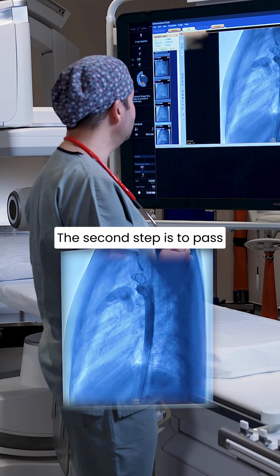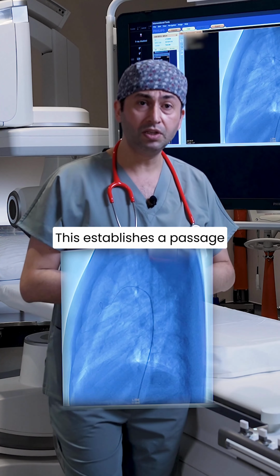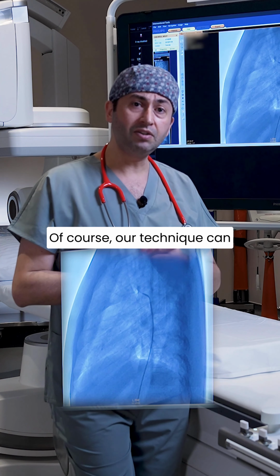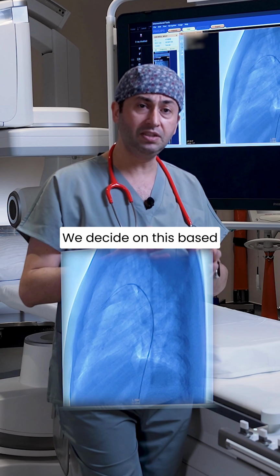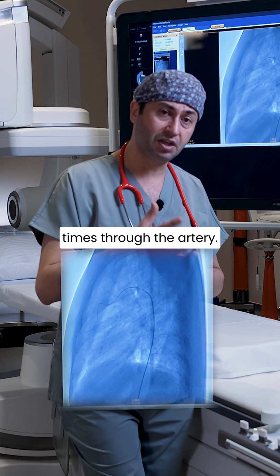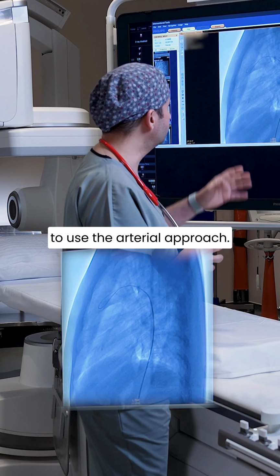The second step is to pass a wire through this structure to reach the pulmonary artery. This establishes a passage through the bridge vessel between the aorta and the pulmonary artery. Of course, our technique can involve an arterial approach or a venous approach. We decide on this based on the size, type, shape, and location of the hole. Sometimes we proceed through the vein and other times through the artery. This was a patient where we chose to use the arterial approach.